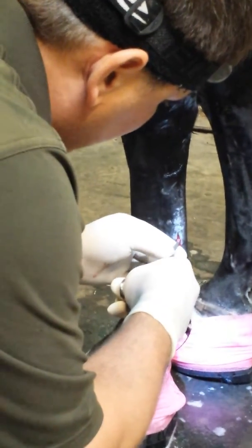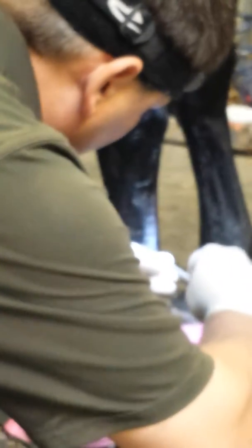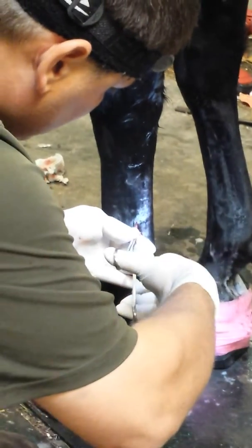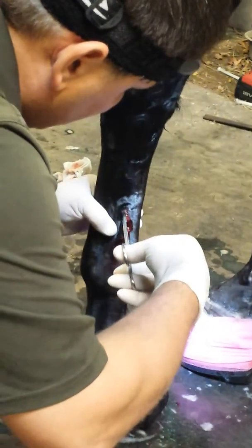Then when you back out, I'm still on the tendon, rotate around, and I want to push through the same hole and go around the front and start a tunnel between the deep and the suspensory. And run that all the way around.